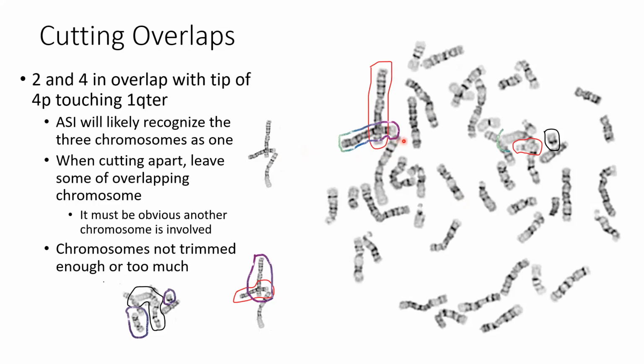Mainly, so when somebody's looking at a karyotype, they can tell that was up against something. Sometimes it can distort the chromosome. This one's not really distorted, but in others it can. When we're analyzing that karyotype to send out a report, we need to see: is that a distortion because of where it was placed in the metaphase, or is there something really wrong and we need to look further?